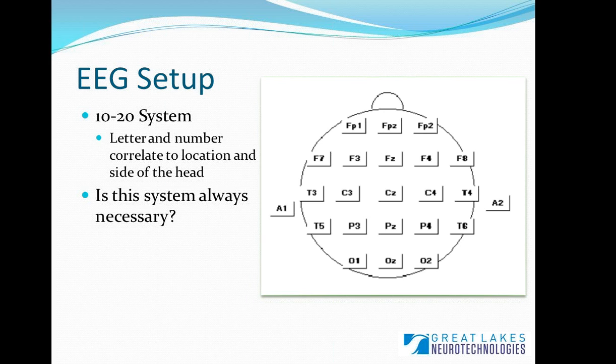Now, there are a lot of research studies going on or that have been completed where people have used hundreds of EEG channels, all the way up to 256. You can do 16, 32, 64. There are so many different configurations. But you can also extract very important and useful information from smaller numbers of electrodes. Even from just 2, 4, or 6 EEG electrodes on the head, you can grab all of the information that I previously discussed, and I'll be able to show that to you.